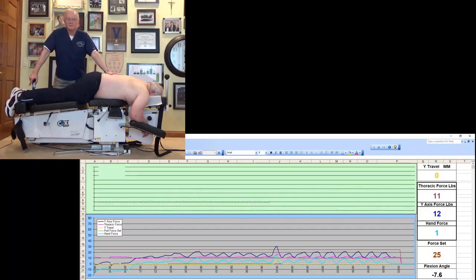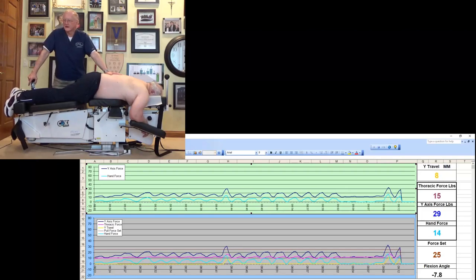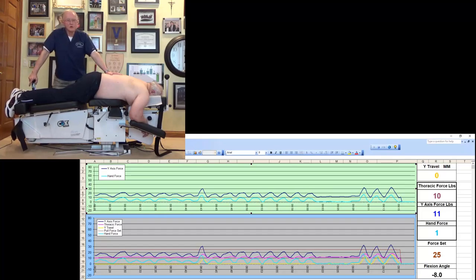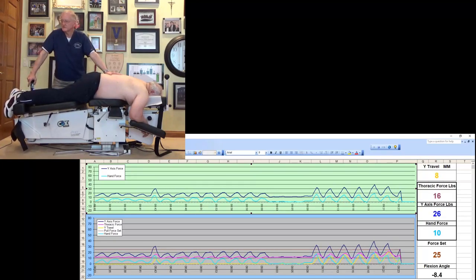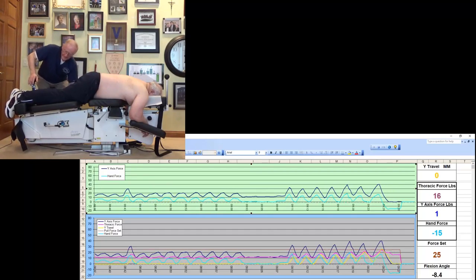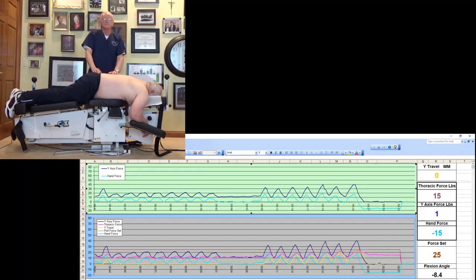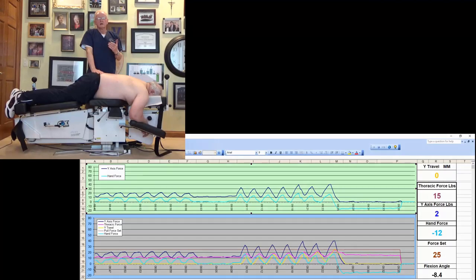Then when I move to automated, patient's responding, centralization of the radicular component, contact four, and I begin automated distraction. And you'll note, it's a very smooth, consistent force. One wants to build up to this with careful tolerance testing of the patient. My intent in studying with you today is to share with you the gentleness of the technique, how you build up to a higher force, and that if the lower force is getting your patient well, so be it.